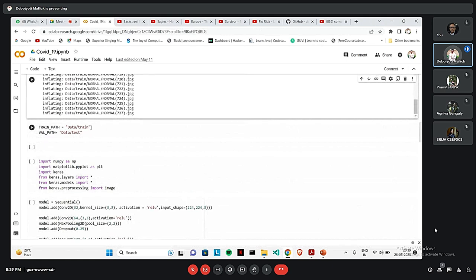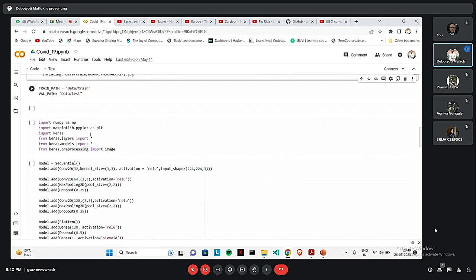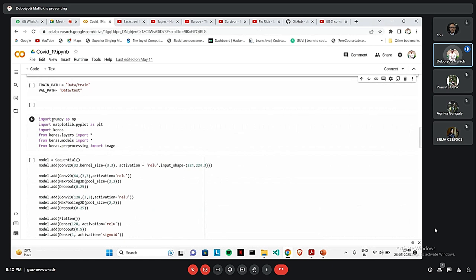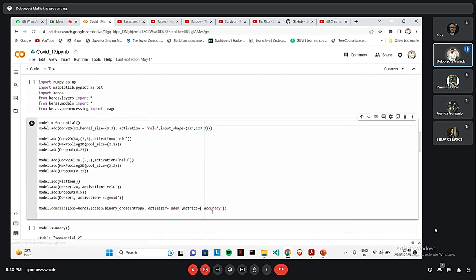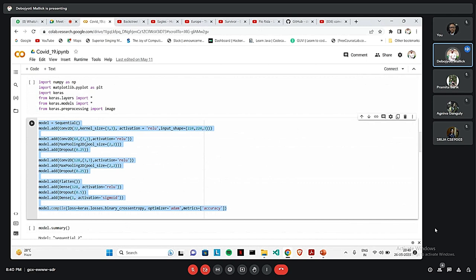The training path we have set, because in the dataset that we have, we have two folders for train and for test. The train path we have set as data/train and validation path for data/test data. We have imported the libraries like numpy, matplotlib, keras for the functions. Here, in this section, we have actually defined how the model will look like. The first is the sequential model. We have added a convolutional 2D network of 32 and kernel size 3 by 3. Activation has been ReLU and the input shape has been 224, 224 and 3.